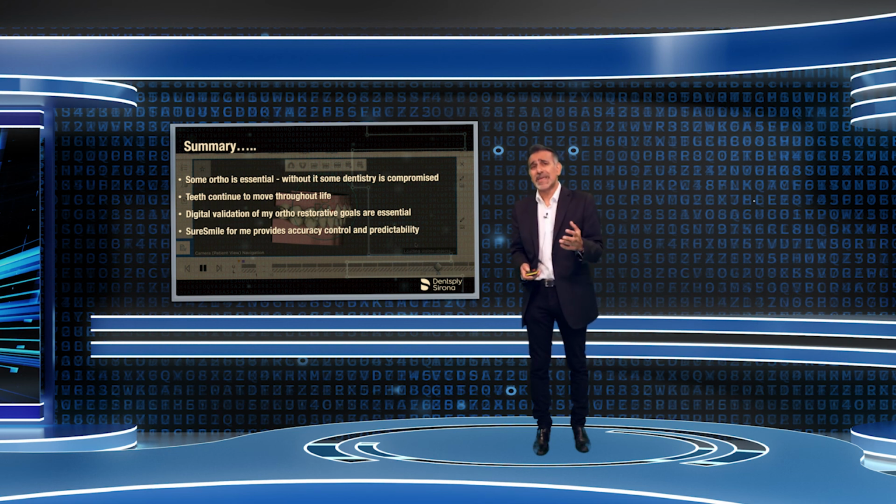SureSmile for me gives me the accuracy and control that I need. Because it's scanned, the software is extremely good, and I find it extremely easy to control. I know that my cases are going to plan out exactly where I want them for those ortho-restorative requirements, and again, without lots of excess aligners. It's been easily the most predictable system that I've used.